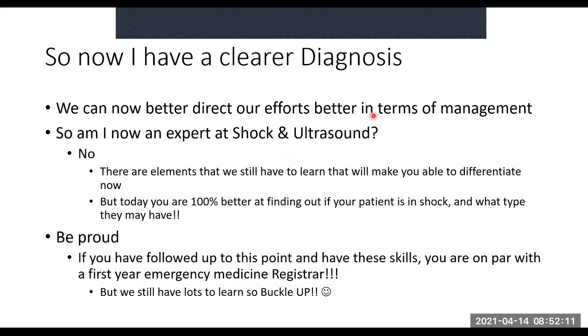So are you an expert now at shock and ultrasound? No, right? There's still a lot of things that have to do with shock and ultrasound, but at least today you're 100% better at finding out whether your patient's in shock and what type they may have, right? Ultrasound in itself is a very complicated thing. It's like ECGs and all that.